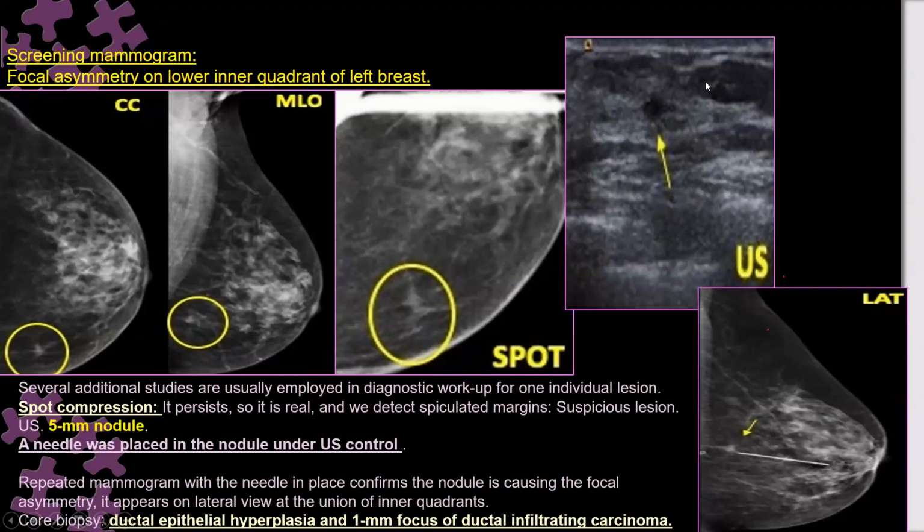Yes, just to make sure we are talking about the same lesion before we send the patient, like the first one. Okay. And the result came different, discordance. At the end, we found that there is mammography ultrasound discordance. From the beginning, in these challenging and doubtful cases, we have to make sure we are talking about the same asymmetry on mammography that corresponds to the ultrasound lesion, and that the biopsy is taken from the same one.